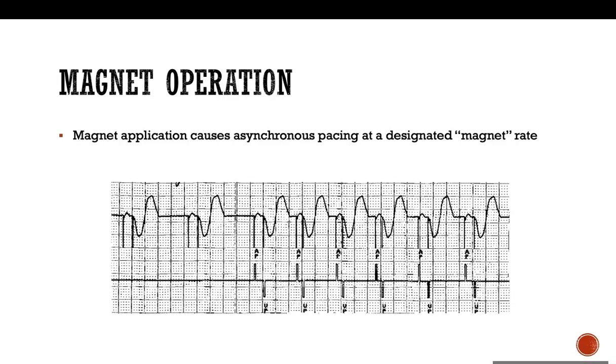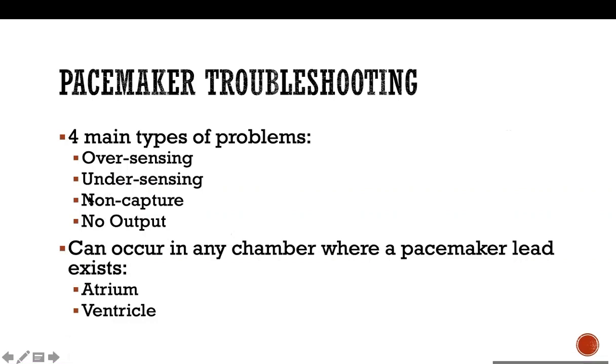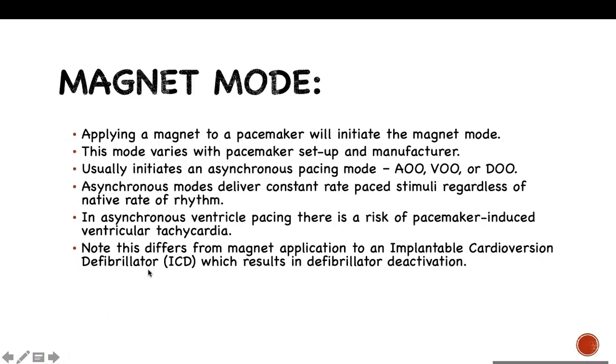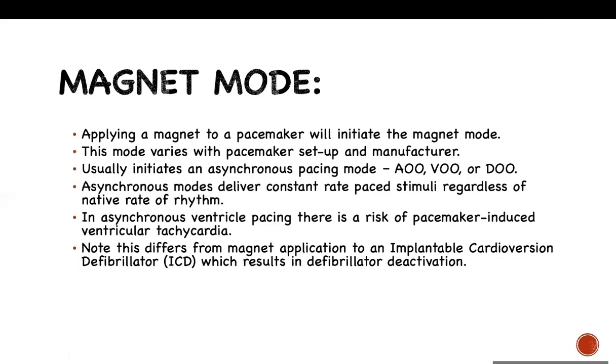Any questions? There are other things we could do in an extra session regarding troubleshooting, like oversensing, undersensing, these things. An extra session if you want to go over it. And a few examples out of ECG. But I think we're done with the magnet here.